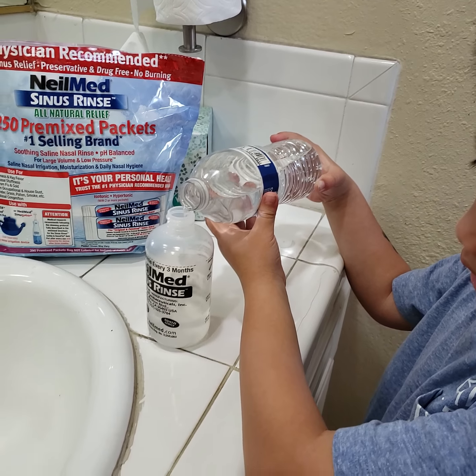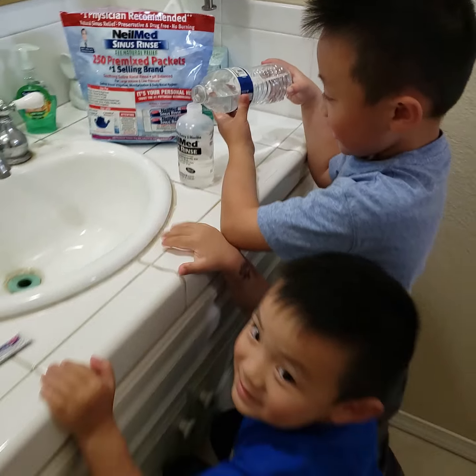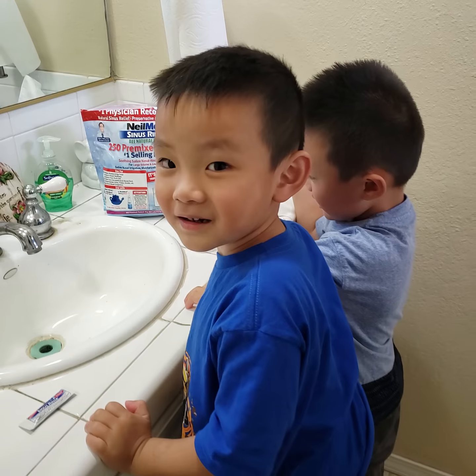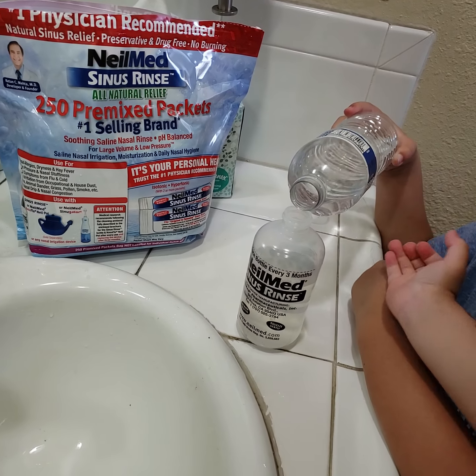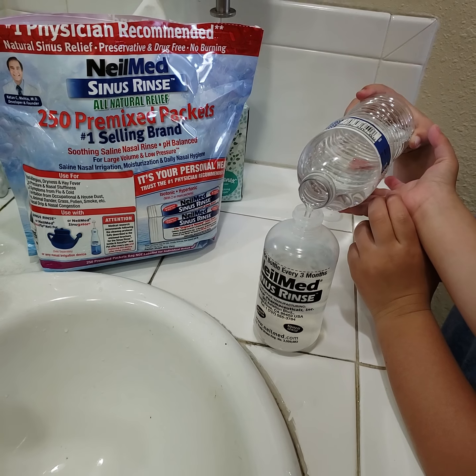He's a little nervous because it's the first time, right? Okay, mommy. And his little brother's trying to help. All the way up.